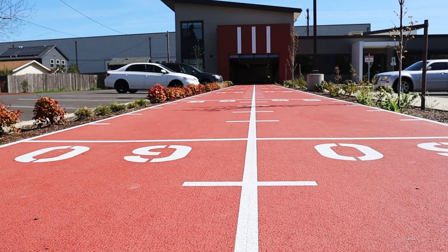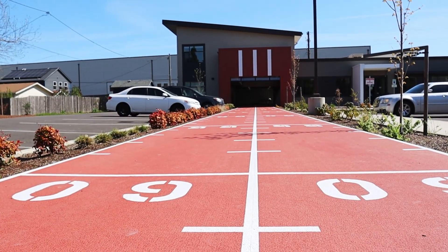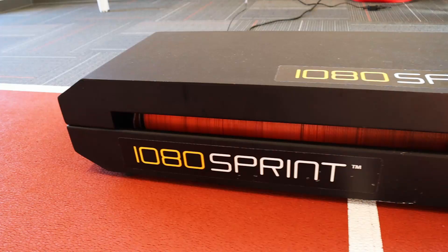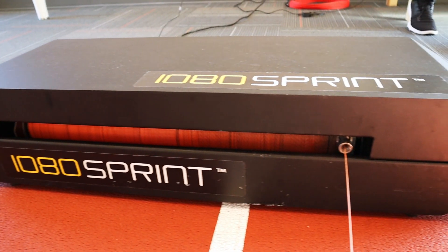My name is Rachel. I'm a physical therapist at The Rebuilding in Salem, Oregon. At this facility we really work to bridge that gap between rehab and performance and getting athletes safely back onto the field and performing at a high level. And one of the tools that we use to do that is the 1080 Sprint.